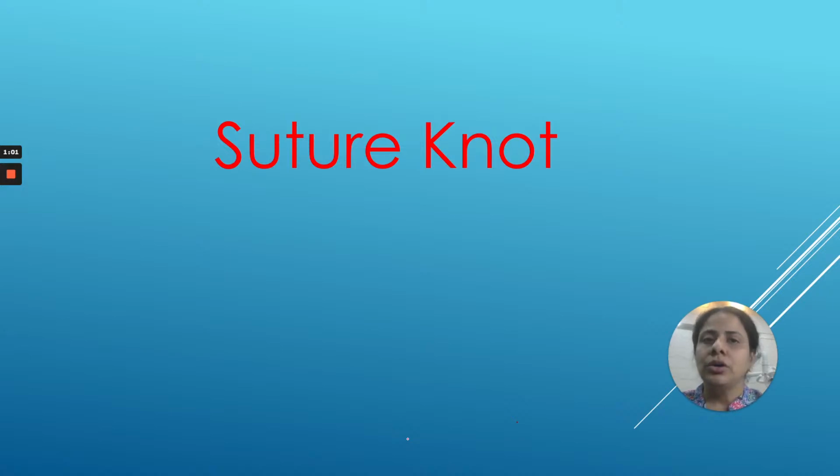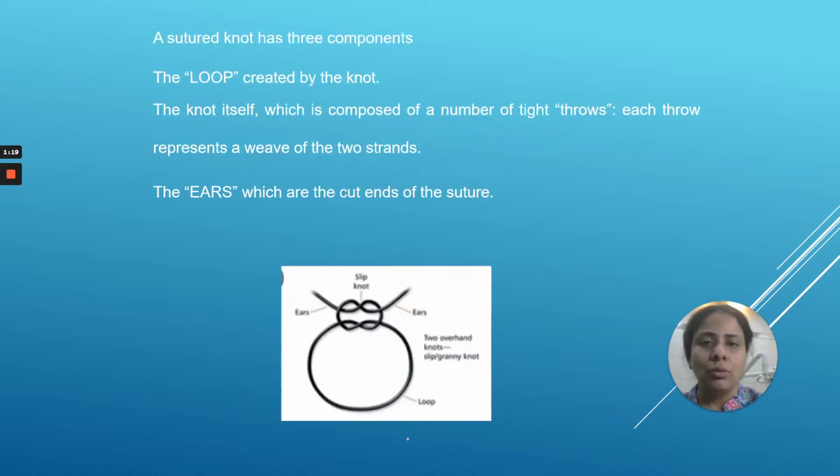Knots, because you will give only one or two types of knots. So just for the sake of understanding, let's understand what a suture knot is, what the different types of suture knots are, and what suture knot you are going to use in your practice when you are giving sutures. So let's go about it.